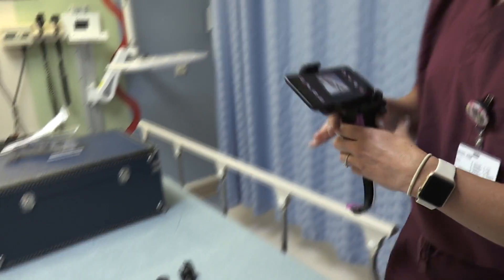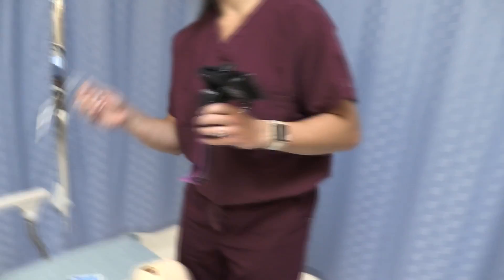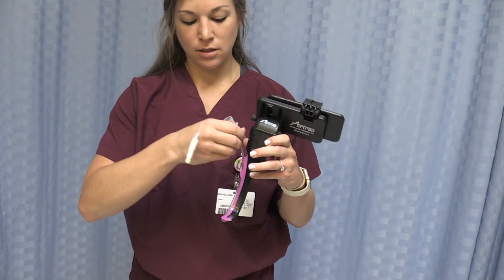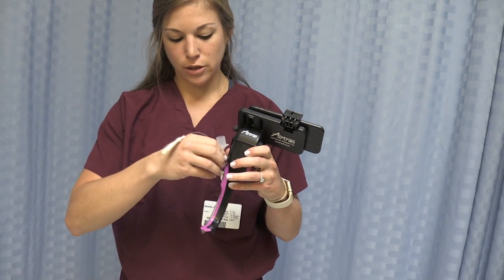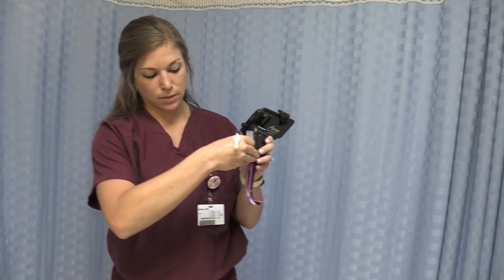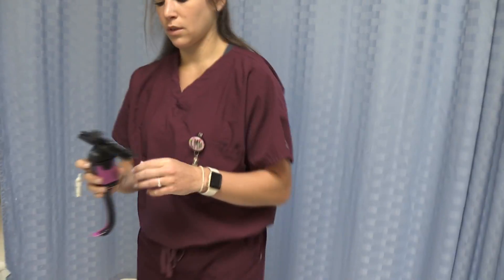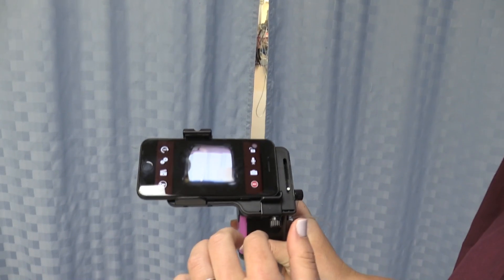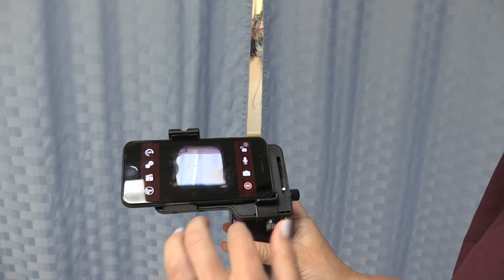Now let's see you do an intubation. I have a lubricated endotracheal tube — you're going to place it through the track just to where the endotracheal tube is at the tip of the AirTrack SP. We can see it on the camera screen when I focus.